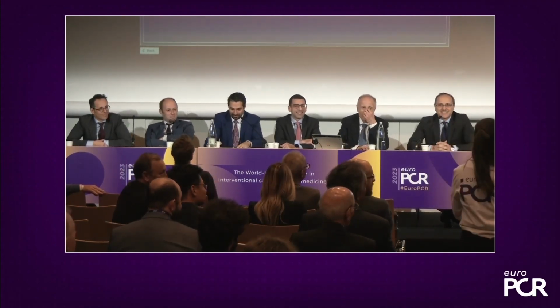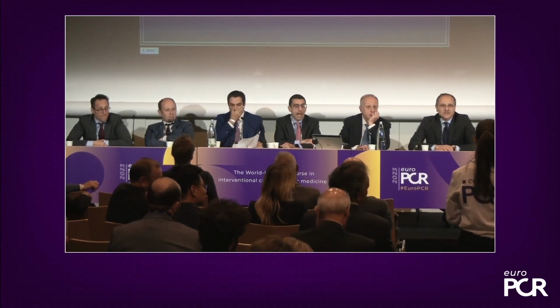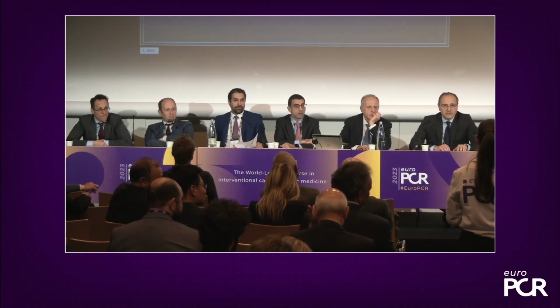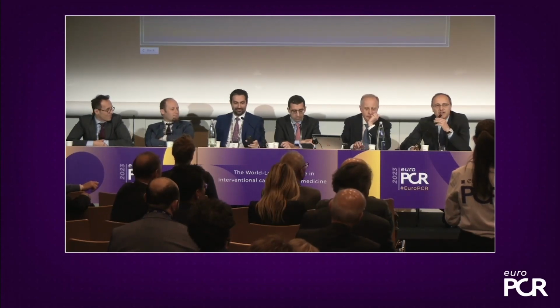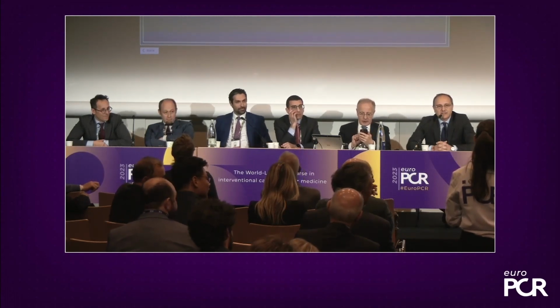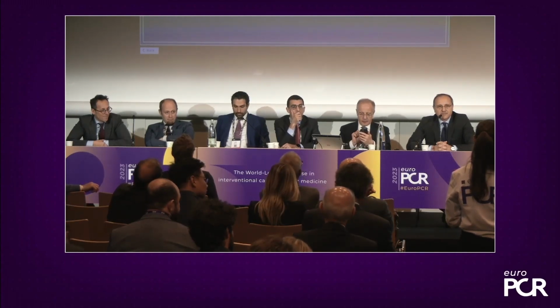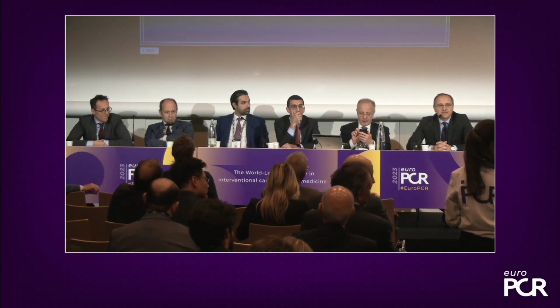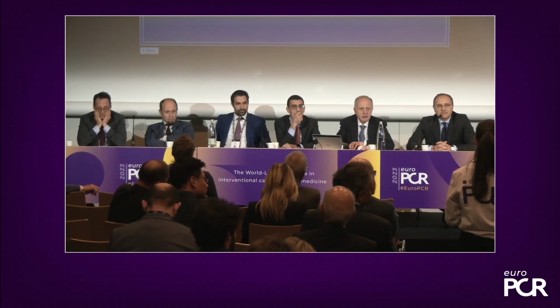Thank you very much, Emanuele. I think it's first of all prognostic. We know that from studies, but to be really practical, I use it for reasons that sometimes my eyes are just neglecting other lesions. Sometimes I think that this lesion is just moderate, but if it's situated in the proximal LAD, left main, or proximal dominant right, it may prove to be functionally significant. People think about FFR as a tool to defer revascularization, and sometimes it's a tool to prove that that point needs to be treated as well.